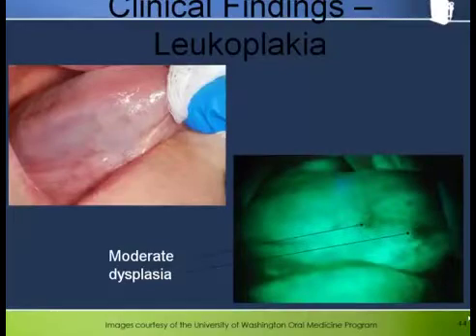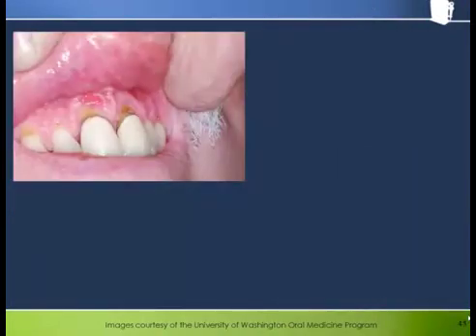Yet another example of the scope showing loss of fluorescence that makes an area of suspicion more visible than in white light. The combination of both visualization methods significantly enhances the diagnostic data for decision making. Look at how dark the anterior area of change is on the scope and how vague it is in the clinical view. The dark areas were found to contain moderate dysplasia.